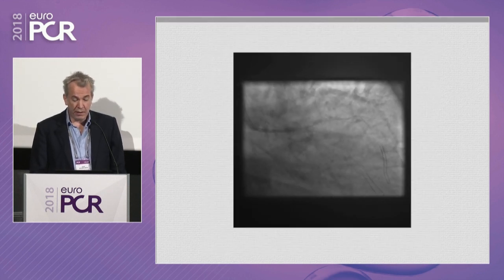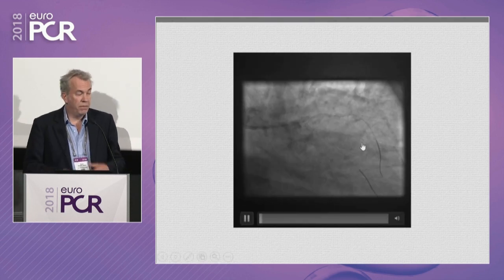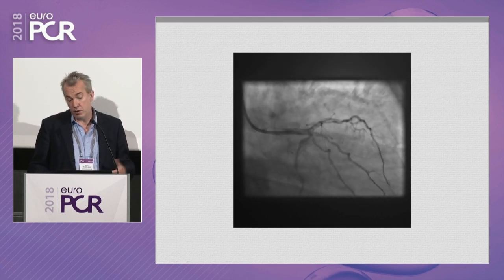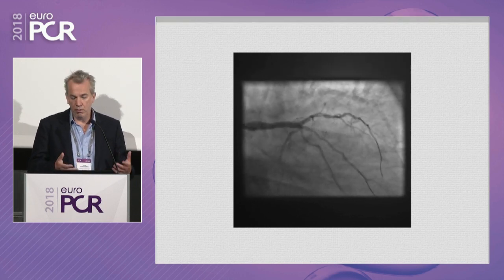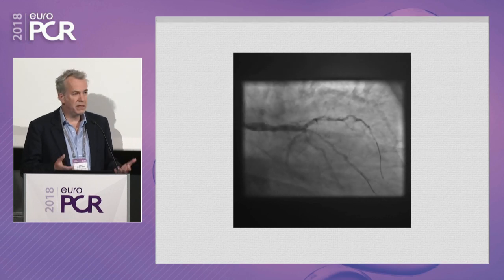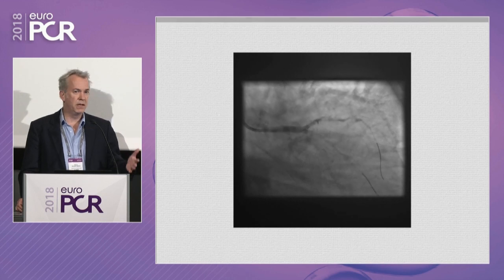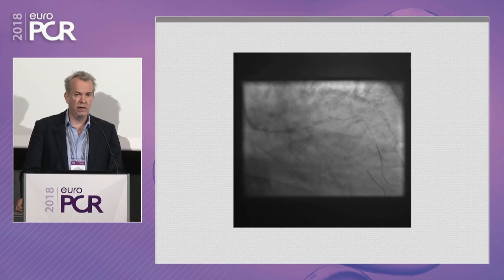They haven't really done anything fancy, but in the end, with a single stent and a kiss, they've reperfused everything, got rid of the left main stem stenosis, got rid of the ostial LAD stenosis, and got a good result into the circumflex, albeit with a balloon only, and preservation of all three branches. So not a fancy procedure, nothing clever about it, but just straightforward, stepwise, sensible decisions each way. And I think that actually is most of our left main interventions.